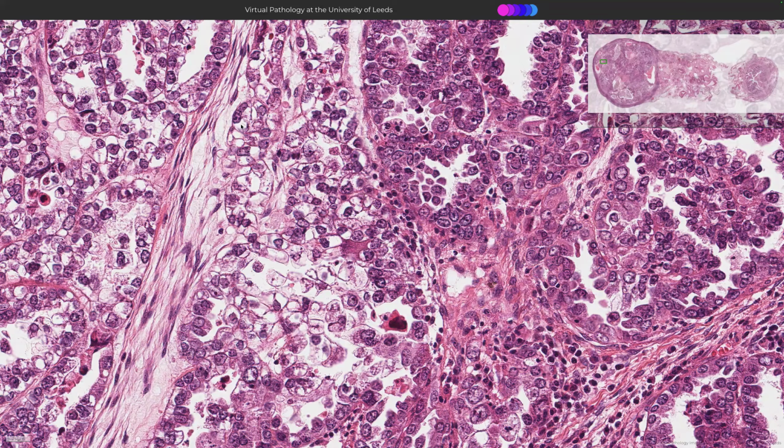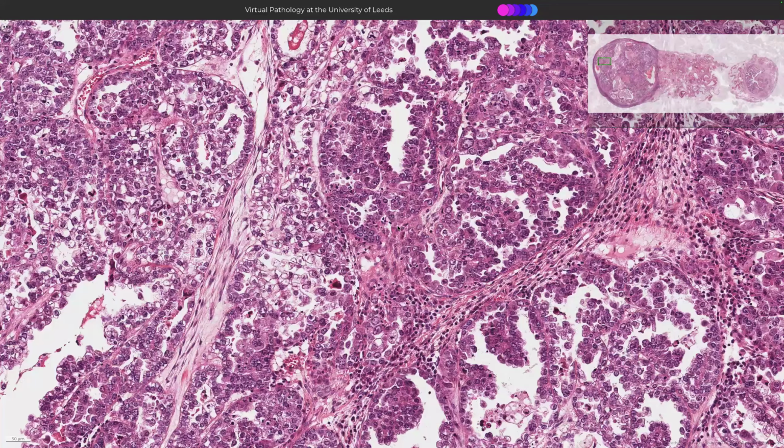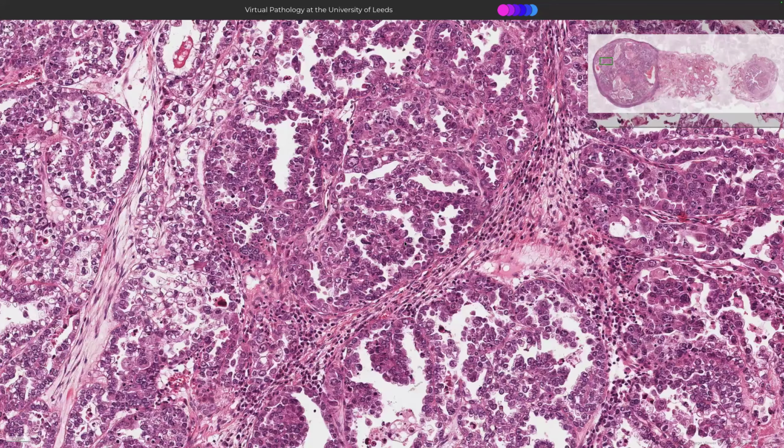It's filled with glycogen, and the nuclei are often central and craggy. And so the morphology is quite important. Look at the way, too, it has hobnail cells. All right, the cells form these little papillae and are hobnails.